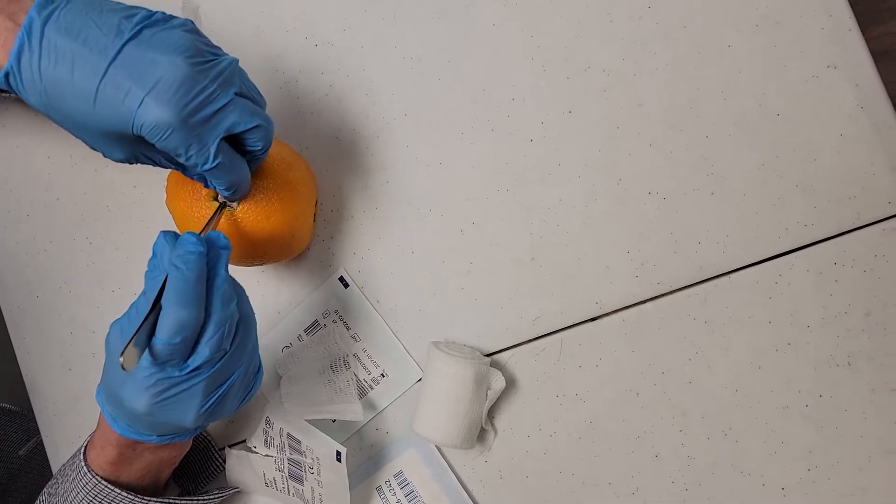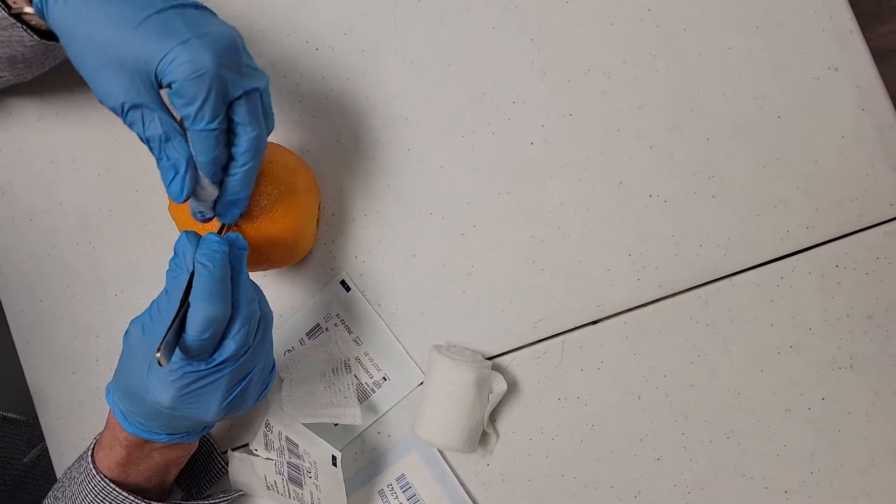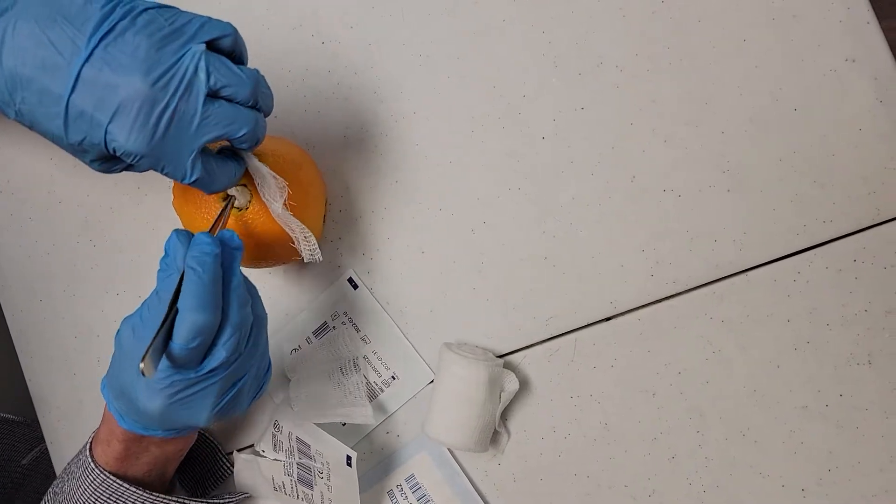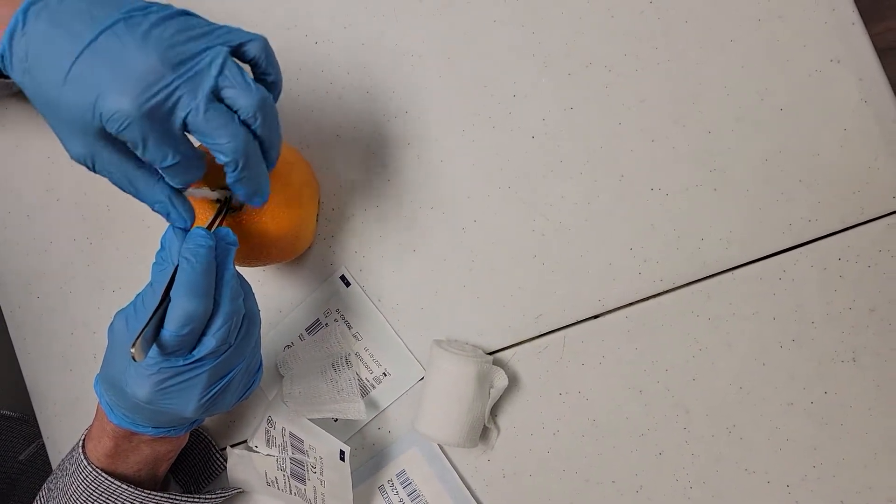Maybe this will work, this 2x2. You just can keep twisting it, make it as small or as big as you need to.